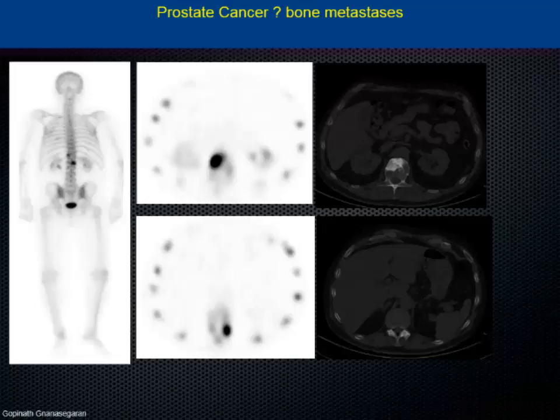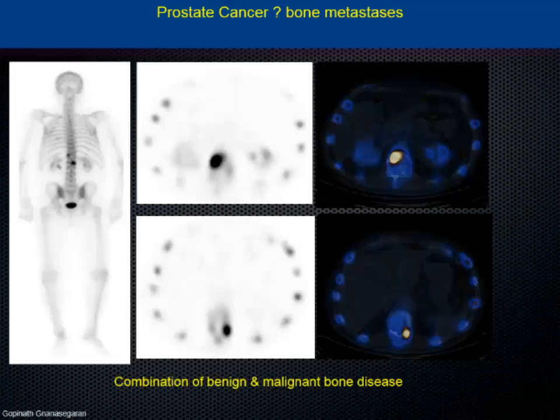And if you can see, that is the sclerosis in the body of the vertebra. So if it's in the body, then it's more likely to be metastatic, that is sclerosis, whereas the sclerosis patchy here is attached to the facet joint disease. So if it is in the joint, it is definitely going to be facet joint disease. If it is the periphery of the body, it could be end plate changes and other things, but if it is a central body sclerotic lesion involving most of the vertebra, then the diagnosis should be metastatic disease. So in this case, what was thought to be both malignant, one turned out to be benign and the other turned out to be metastatic disease. Therefore, we give a definitive and confirmative diagnosis in these patients.